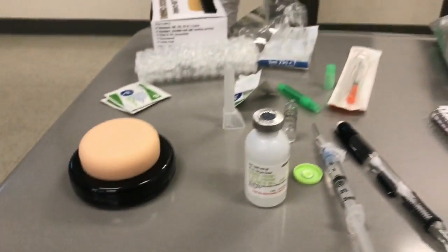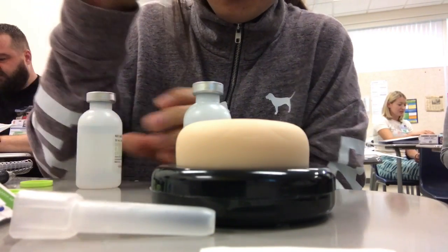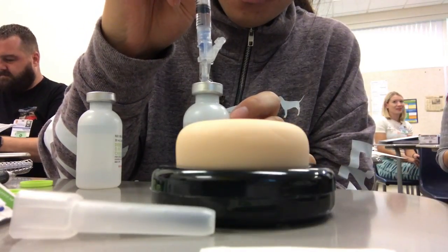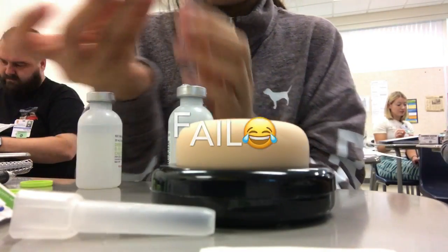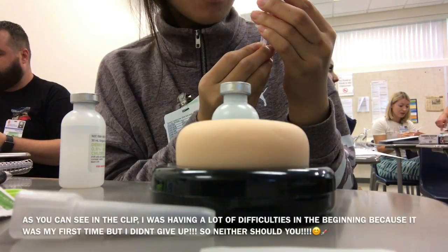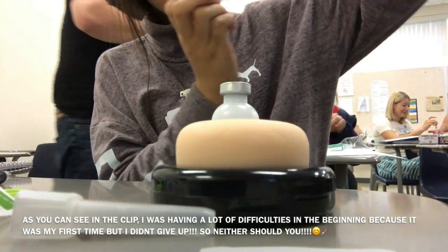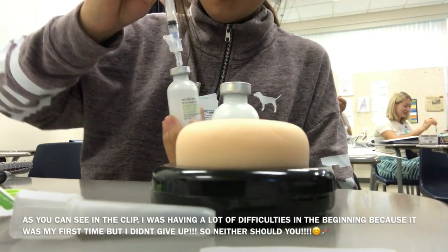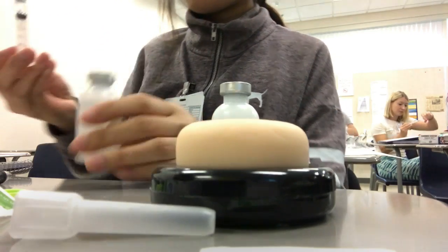You need an inject. Oh, oh my goodness. Oh, jeez. Okay. One. And then... Oh, my gosh. That came in so fast. Okay, I'm messing up. I need to do that.